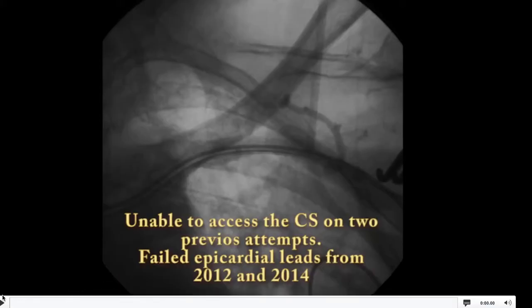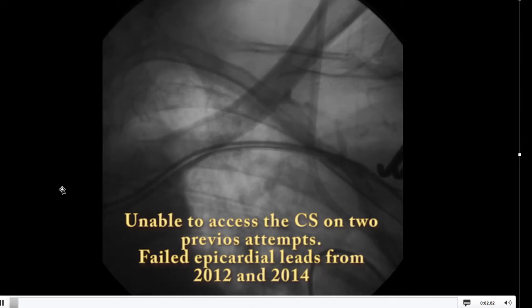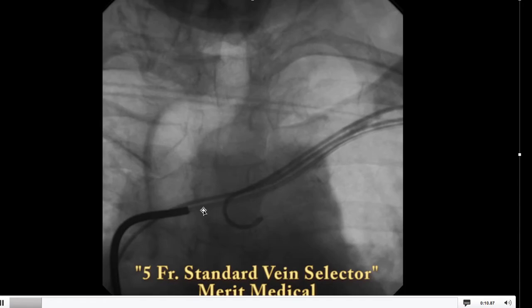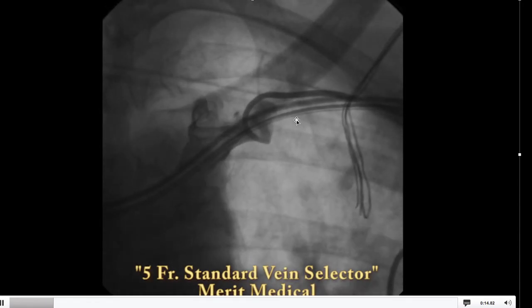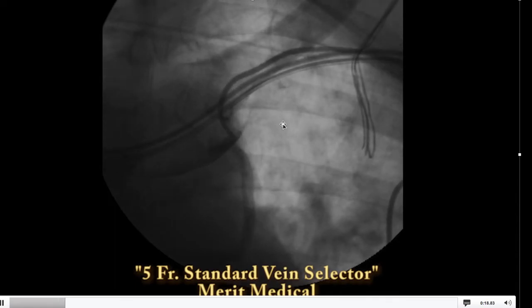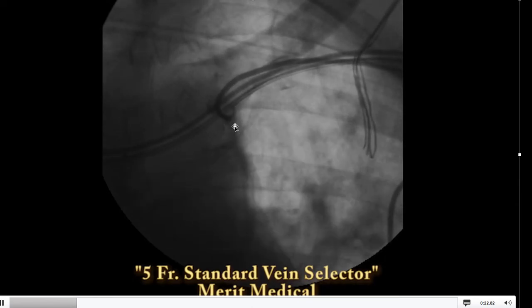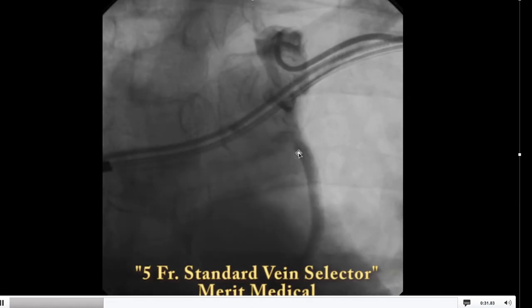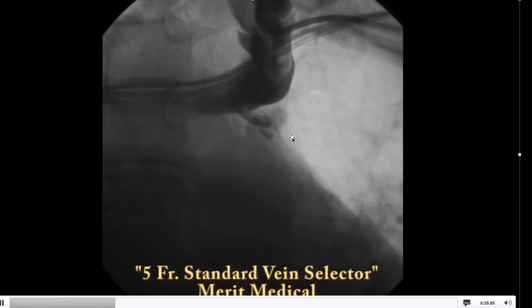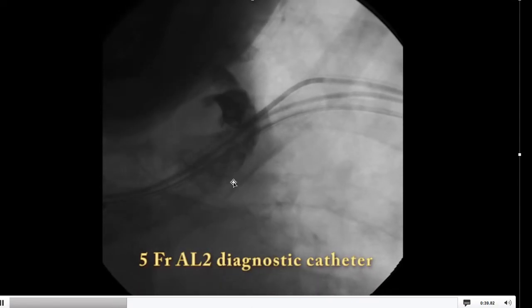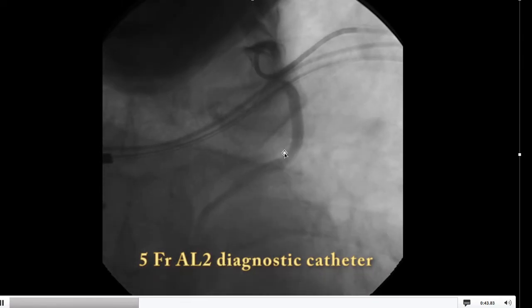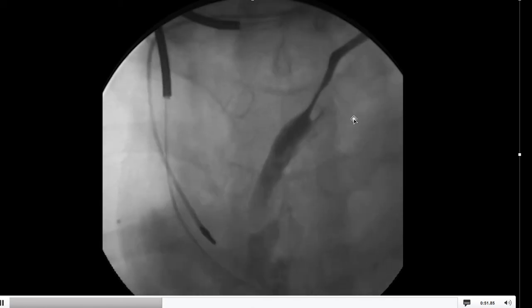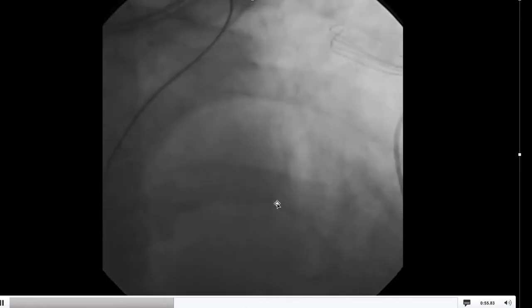This patient had two previous attempts at LV lead placement, both of which were followed by epicardial leads, both of which subsequently failed — so this was a last resort. I was looking very hard for the persistent vein of Marshall and couldn't find it using the standard Merit vein selector, which is what I usually use. I had to switch to an AL2 — a five French diagnostic AL2 — to finally engage the branch. Being fairly certain that there had to be something here, we were eventually able to locate the vein of Marshall. You can see the vein of Marshall enters the CS right by Thebesian valve.